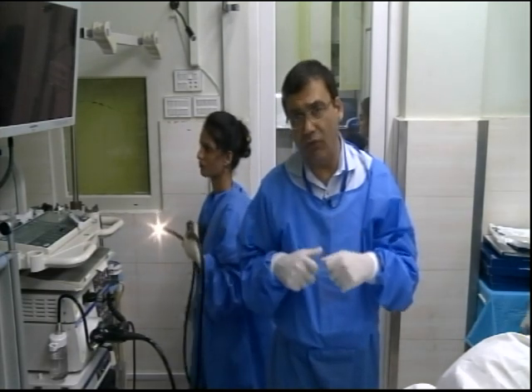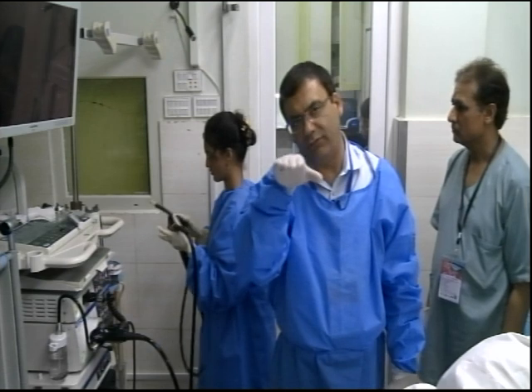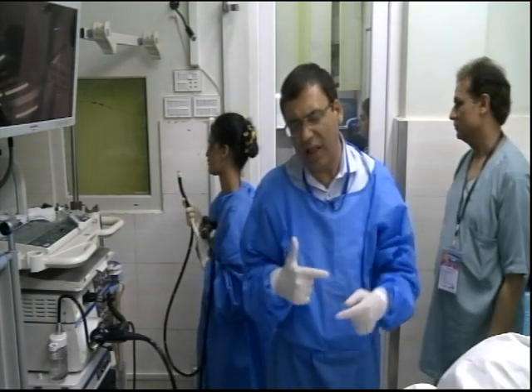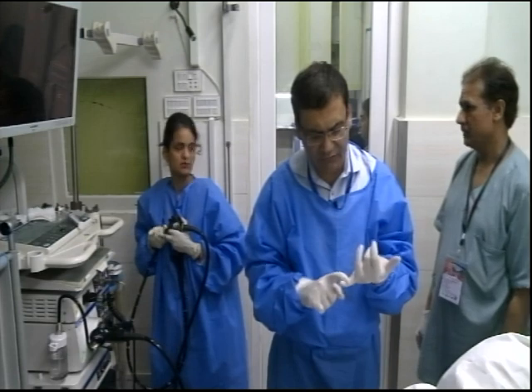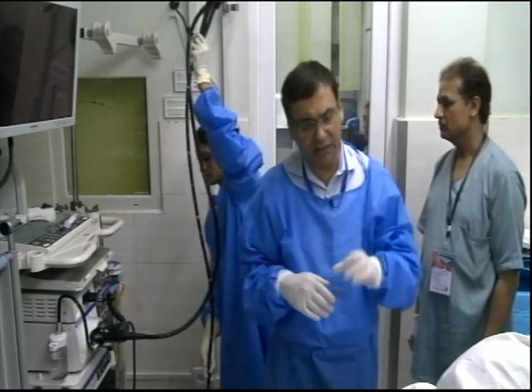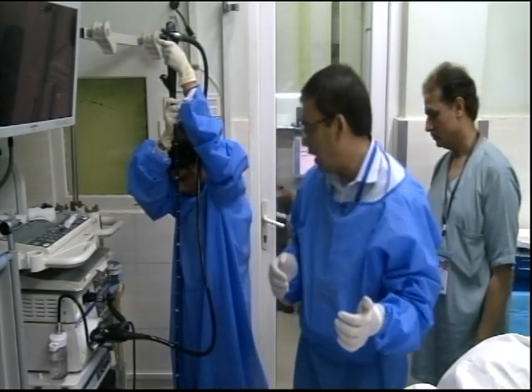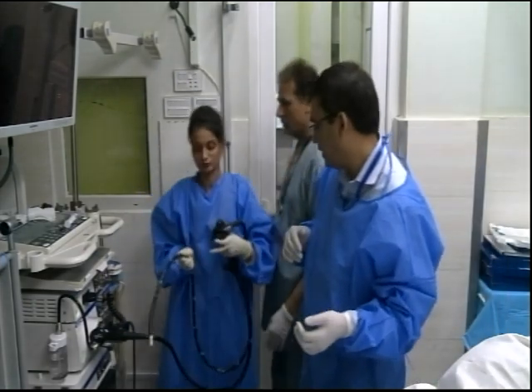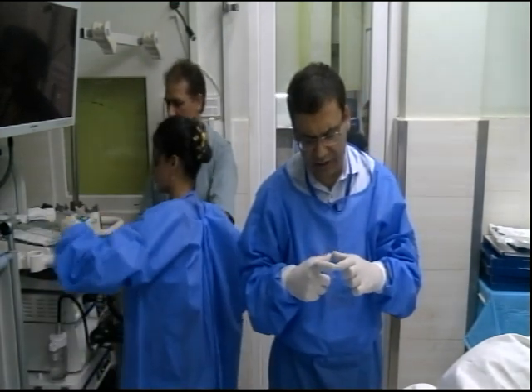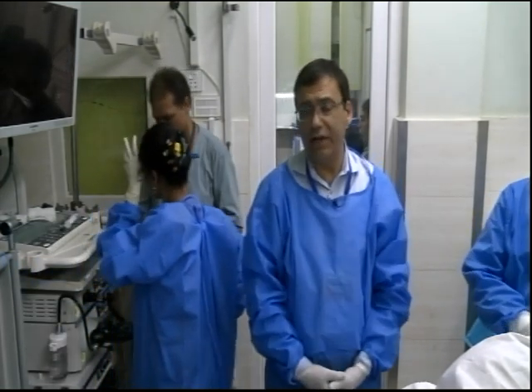Having said that, we can at least see what the thickness is. Is there really any tumor extending outside the muscularis propria, if it still exists? And you can also take a look at the lymph nodes, even though that is not accurate either, because if there is radiation or chemo, the same process happens in the lymph nodes. They can look like more organized lymph nodes, but that may be just a fibrous lymph node with fibrosis. We're trying to set up a scope. In the meanwhile, if there are any questions besides what I said, I'll answer those. Any questions about this?